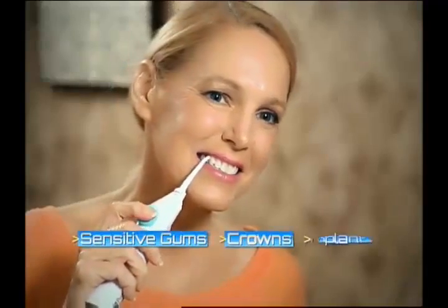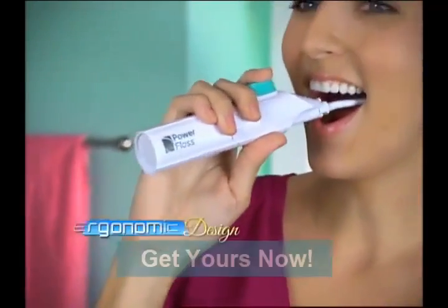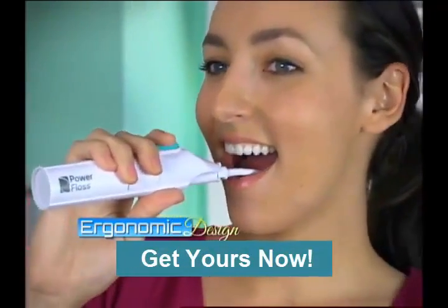Power Floss is great for kids and adults with braces. It's ideal for people with sensitive gums, crowns, implants, and dental work. And with its low-profile tip and ergonomic design, your back teeth are easy to reach.